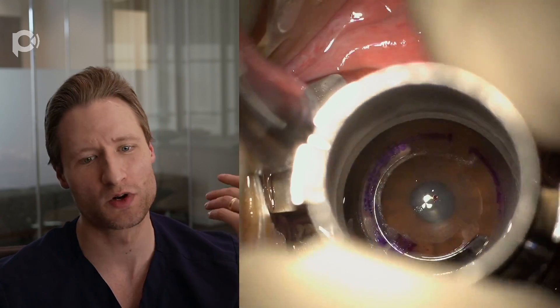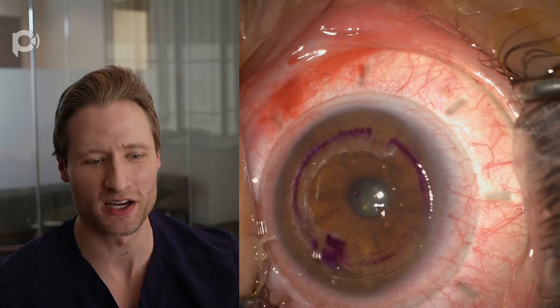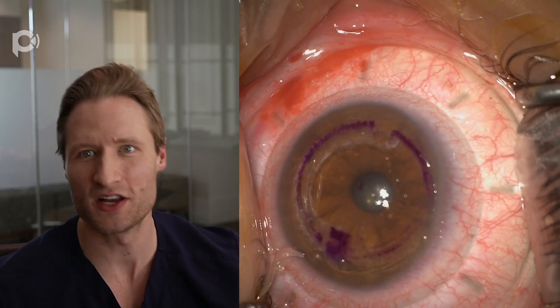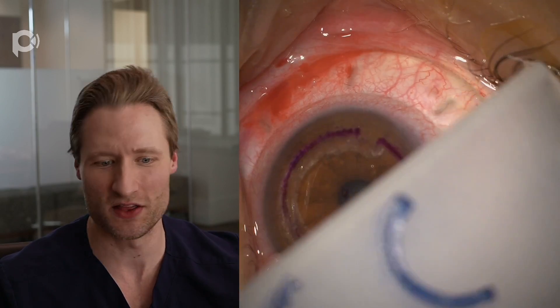You'll notice this is really quick and really easy — this doesn't require a femtosecond laser, the patient tolerates it well, and it's done. The channel is now created, the incision is made.